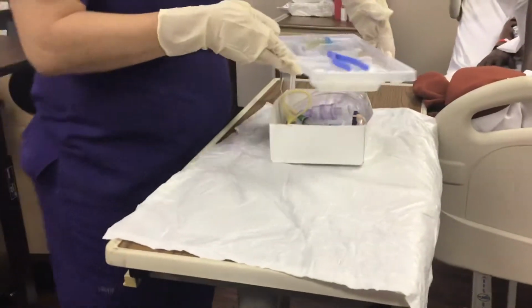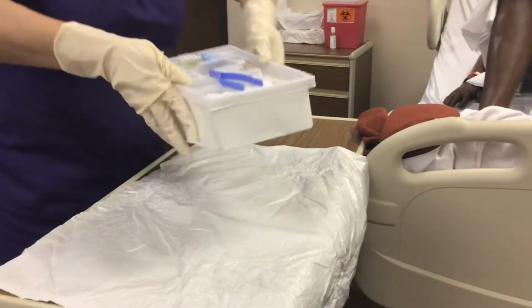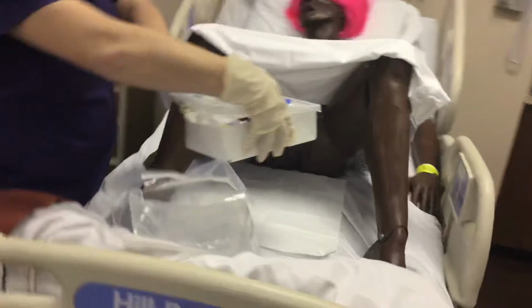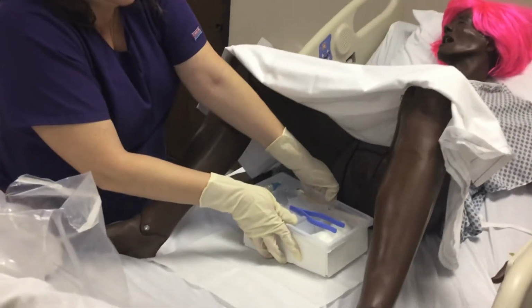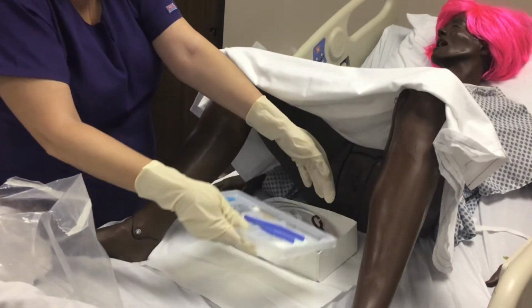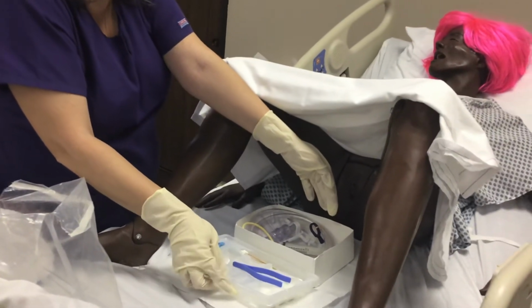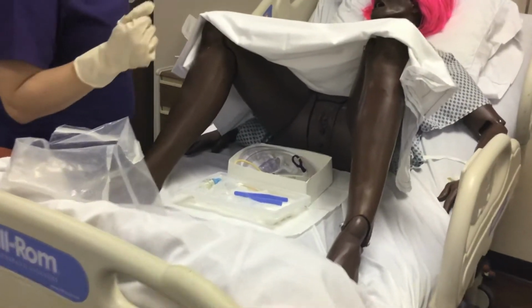I'm going to put my lid, take it, turn it. My catheter end, I'm going to put closest to my patient, still maintaining that 1 inch barrier all the way around my field. Okay?